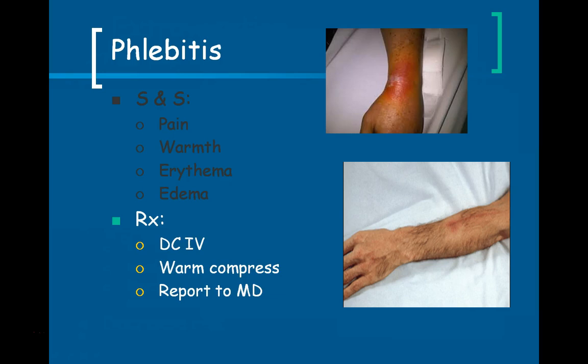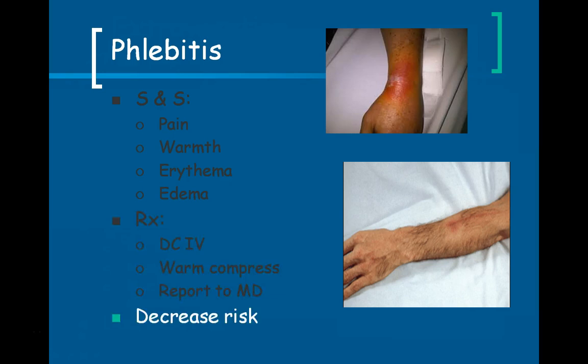The other thing is we want to make sure and educate the patient so that they know what to look for. Phlebitis can actually occur up to 4 days after an IV's been discontinued, and often when we're discontinuing the IV is when the patient is going home. So we want to tell them to keep an eye on the IV site for the next several days, and if there's any redness or pain or tenderness, they should call their physician.